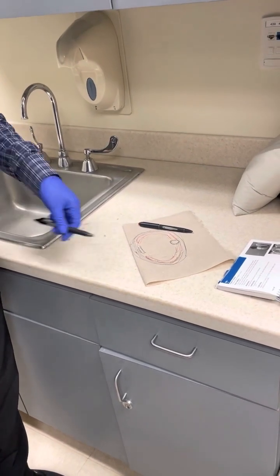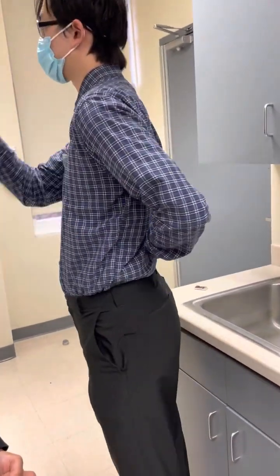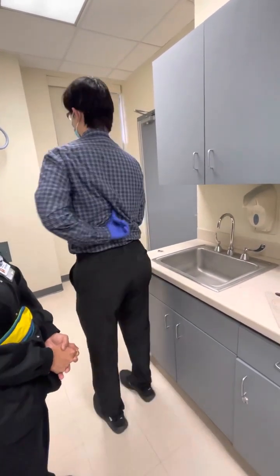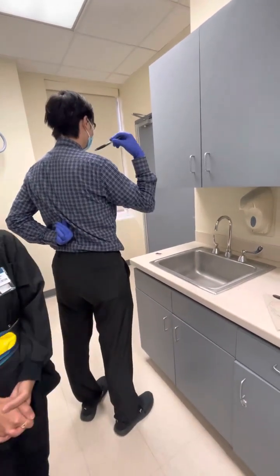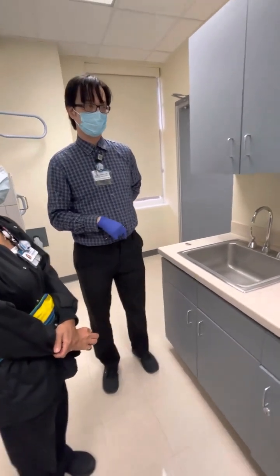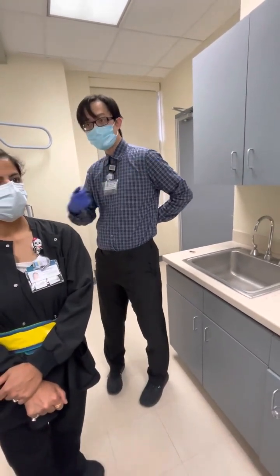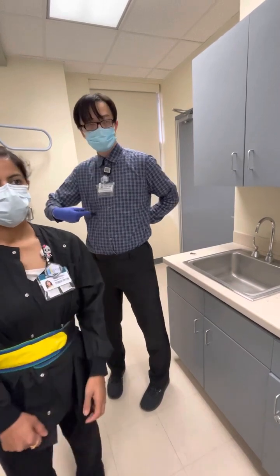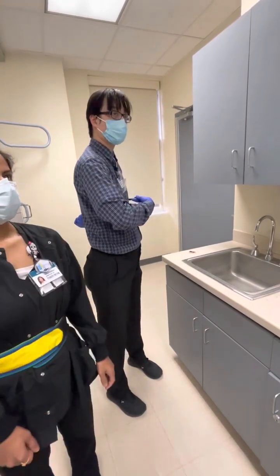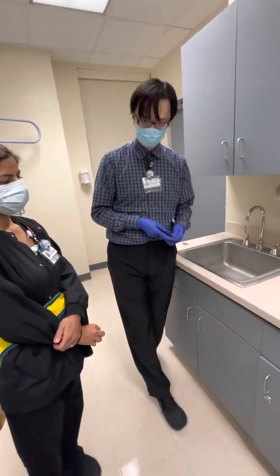going to be. Right? So you feel your spine, you're like, all right, I'm like this. I turn RAO. Okay, spine is going towards the right. It's going to be on the right side, so I want to be looking at the left ribs. Right? If I go LAO, spine moves towards my left, so I'm going to be looking at the right ribs. Right? If I'm doing this as like an RPO, when I turn this way, my spine is going to the left, so I'm looking at the right ribs on my RPO. I turn this way, LPO, spine's moving towards the right, so I'm looking at the left side on my LPO. It's just all about where the spine is not going to be. Does that make sense? Right, great.